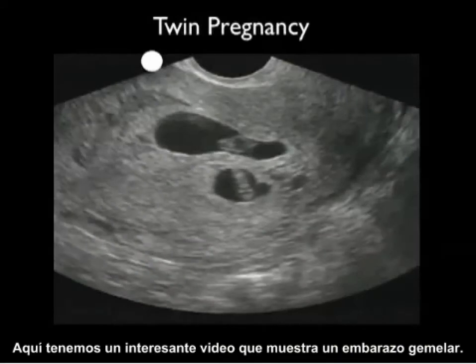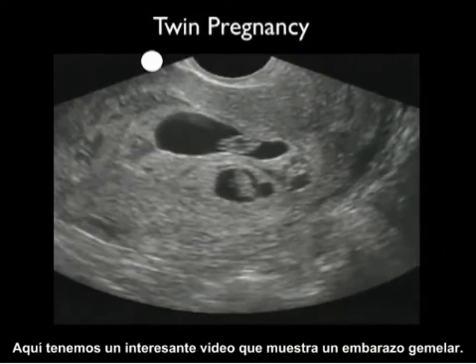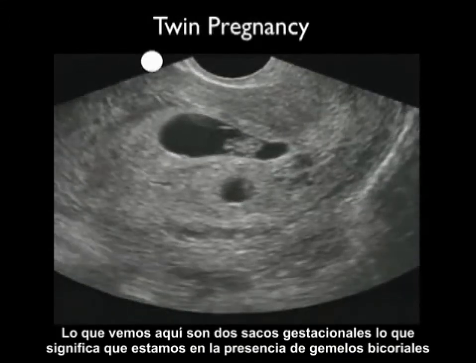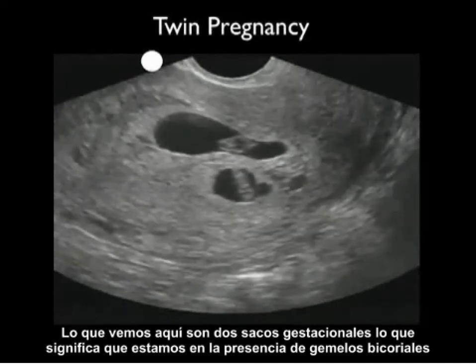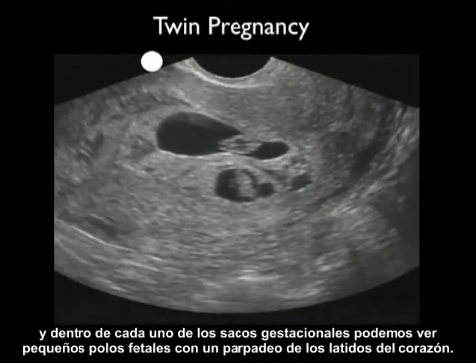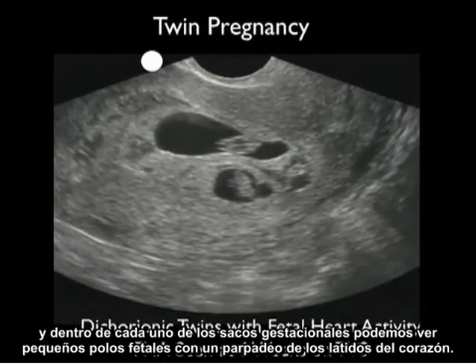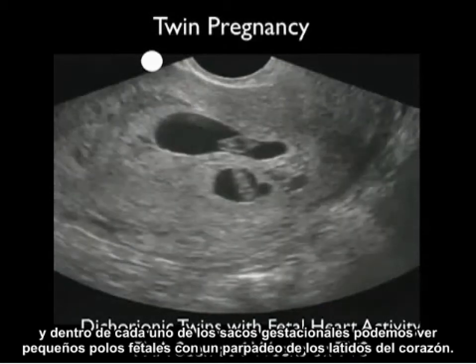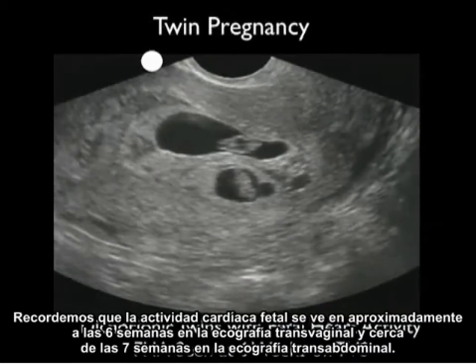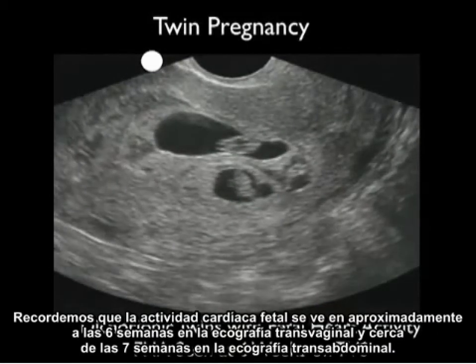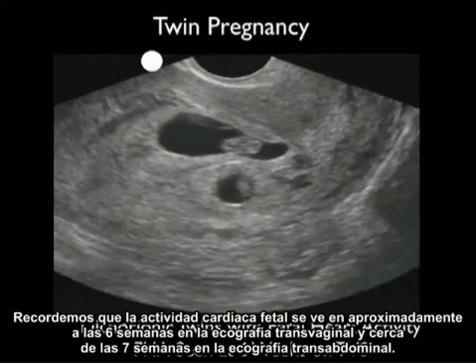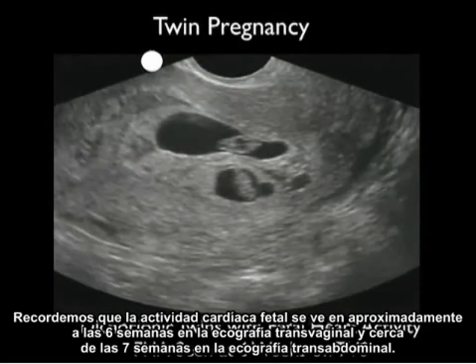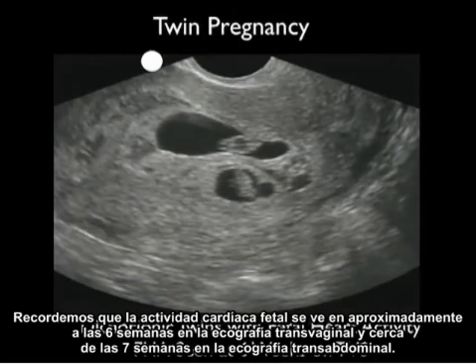Here's an interesting video clip showing a twin pregnancy. We see two gestational sacs signifying dichorionic twins, and within each gestational sac we can see little fetal poles with a flicker of heartbeats. Fetal heart activity is seen at about 6 weeks on transvaginal sonography and about 7 weeks on transabdominal sonography.